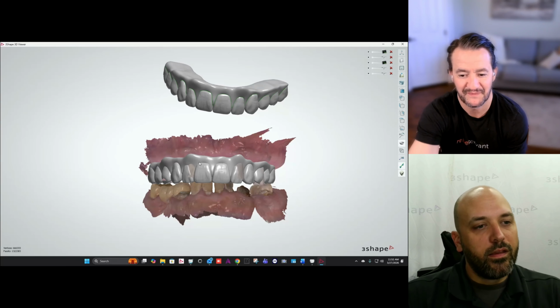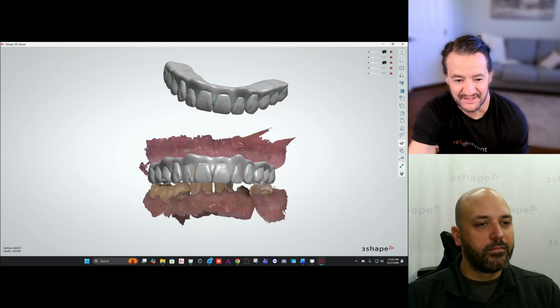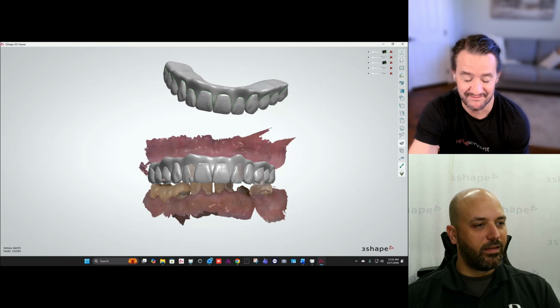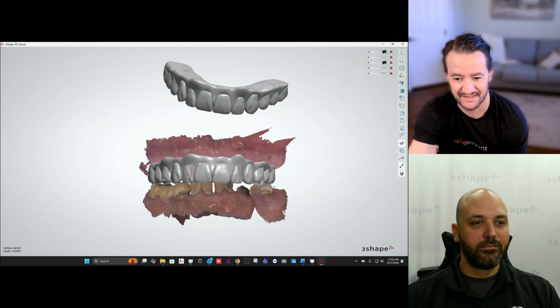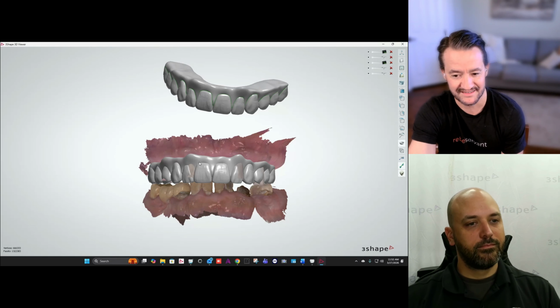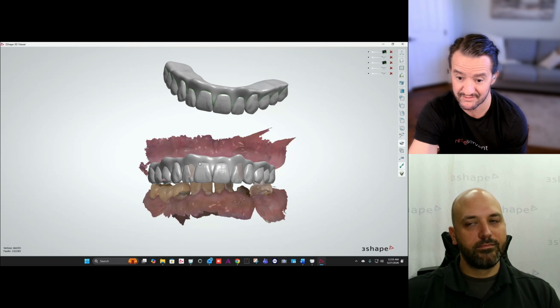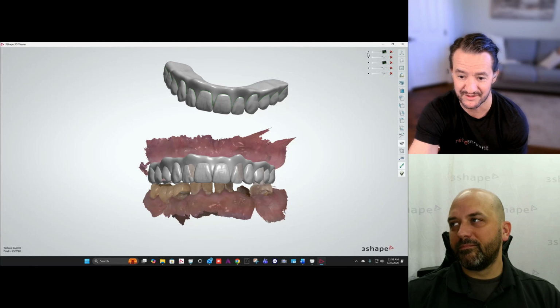I love it. Brandon, thank you so much for sharing this super valuable insight. I would say this is a pretty critical element to know as a digital CAD designer in a digital workflow, so that you're not constantly having to start from scratch and you're utilizing the data that you have.